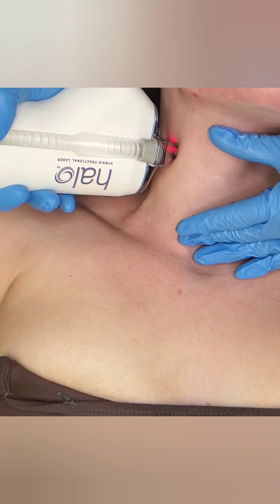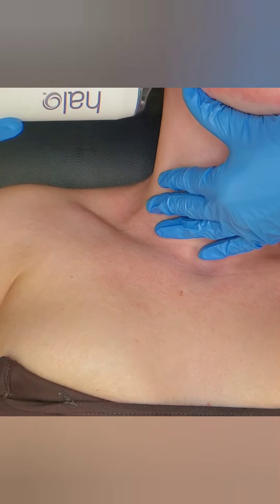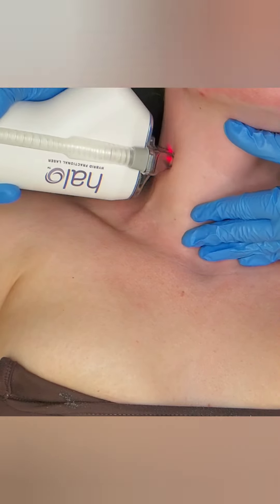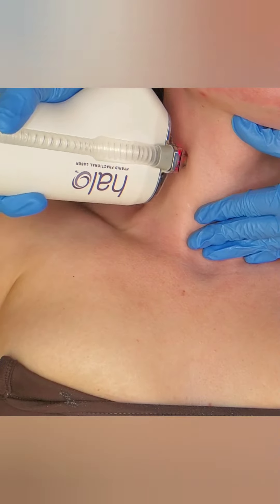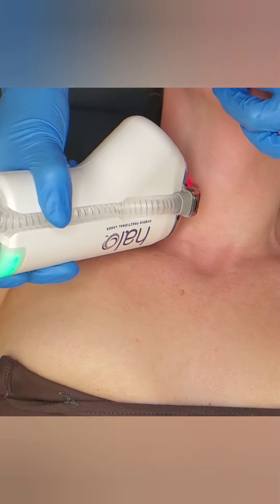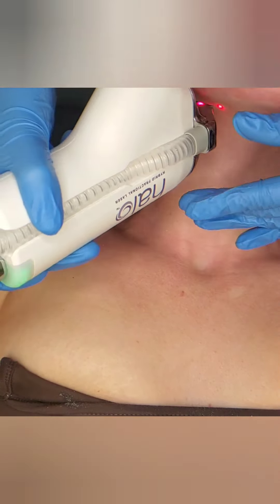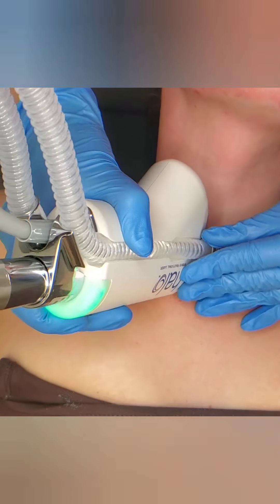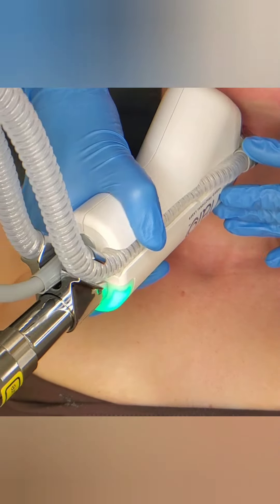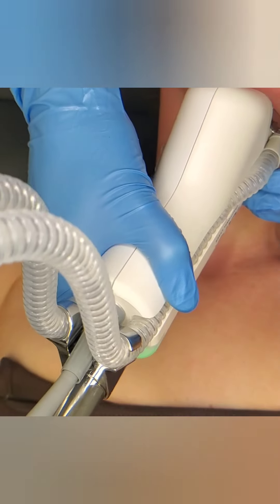Halo can be done on the body — as you can see, I'm doing her neck. I personally include the neck with every face treatment. Some providers and trainers think I should charge more, and it is a little more work, especially with Halo — but it's going to make your results amazing and to me it's worth the extra effort. You can also do the chest, back, arms, and anywhere on the body.